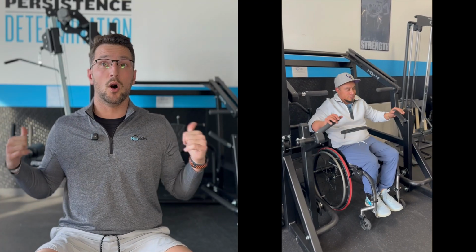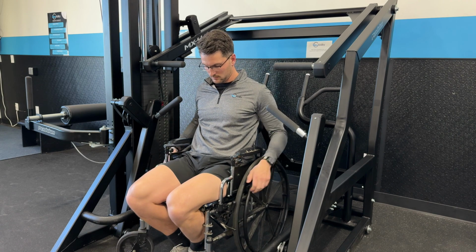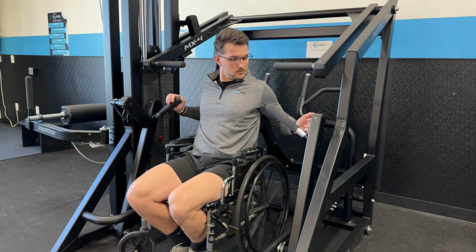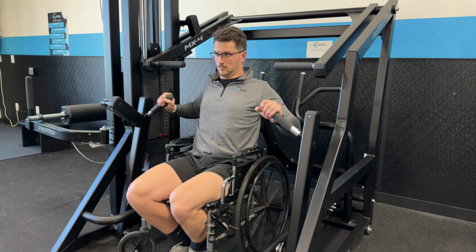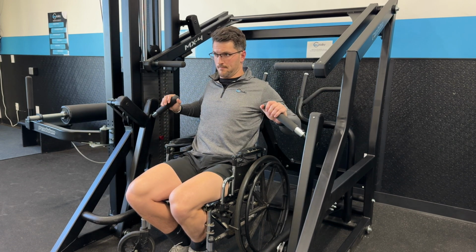The other ones that we have with this machine are chest press, which is pretty cool too because it's got a nice small back support, and that's also adjustable. That means you're able to get a lot of range of motion, really get your shoulder blades pinched back behind your arms, and get your shoulders set to do a solid press motion. On top of that, it has adjustable handles that can start out wide and then move in if you're looking for more of a close grip type pressing motion. Again, really functional for our wheelchair users to help with strength output, transfers, wheelchair propulsion, activities of daily living, things of the sort.